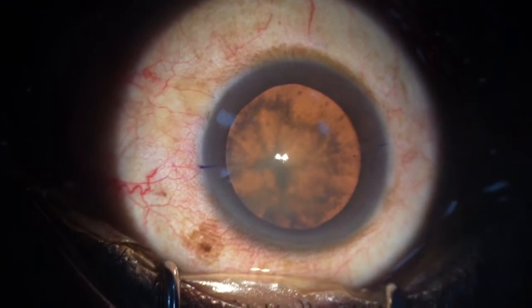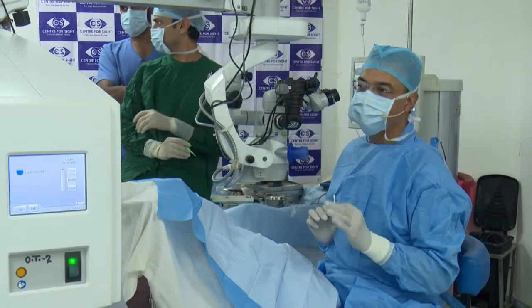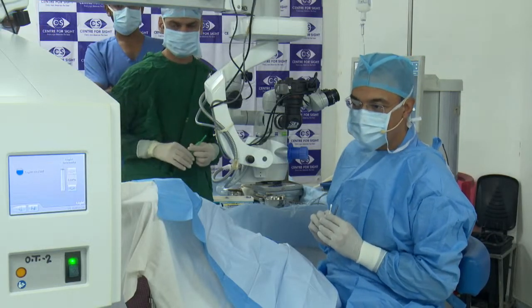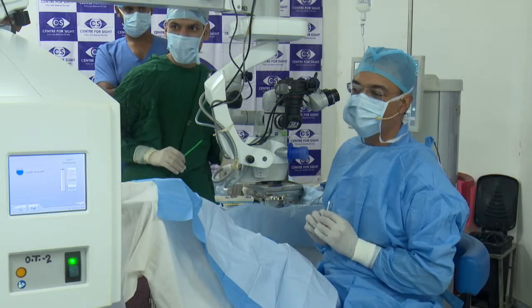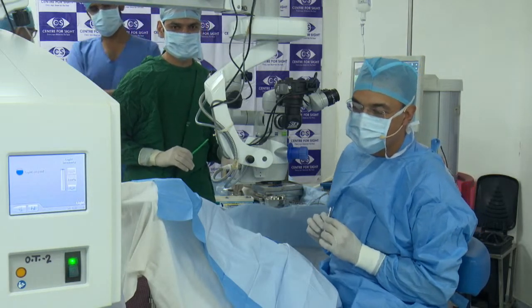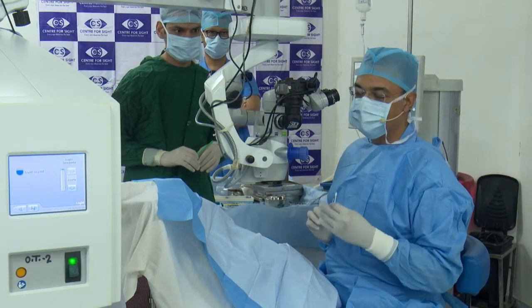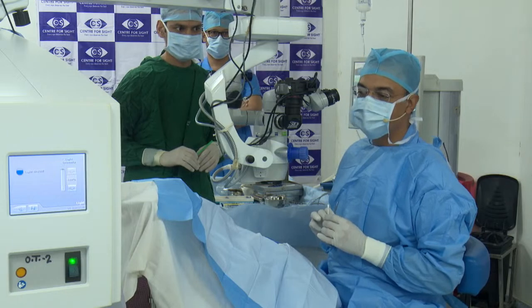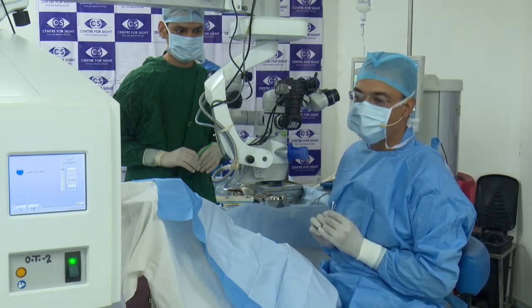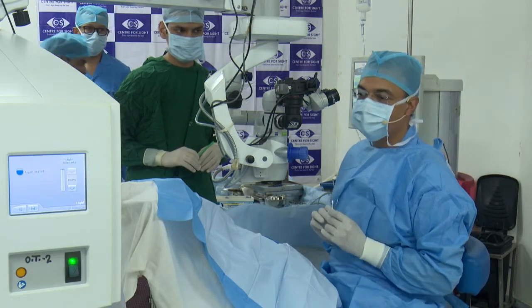So my patient is a 49-year-old lady, bilateral cataract. This eye was finger counting 3 meters, improving to 6/24. She has astigmatism of about 0.76 diopters at 14 degrees. So we are planning to implant a geometric toric lens. I like to use toric whenever I need to, even with very small astigmatism, I don't hesitate to use a toric lens. So here we are going to be using a 1 diopter toric lens and a plus 22, and this is a geometric lens.